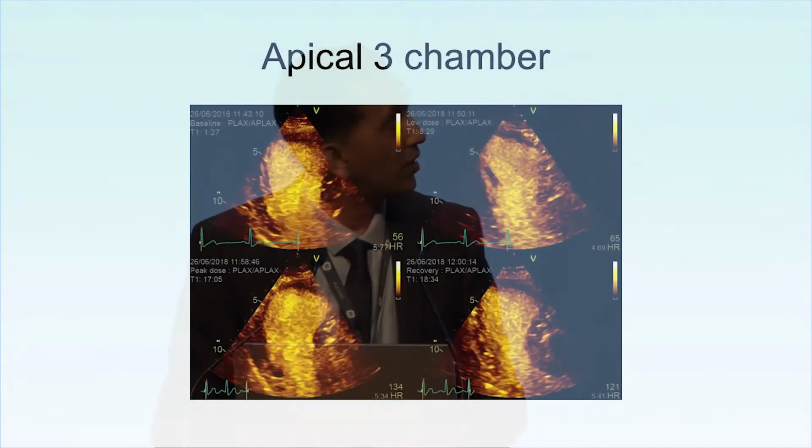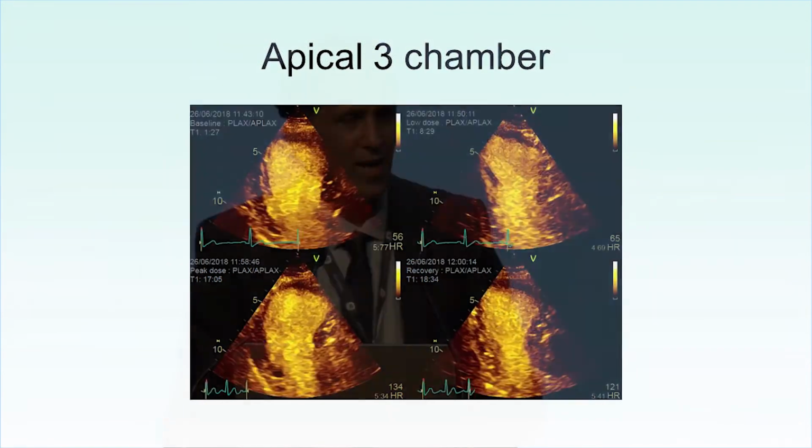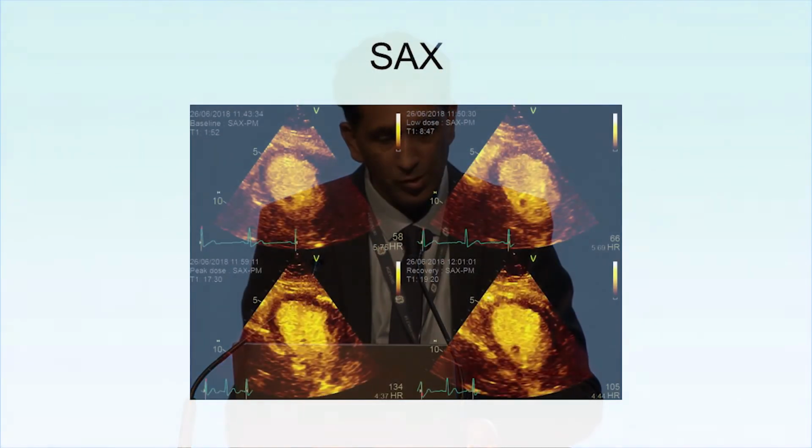So clearly there is something not right there for this patient. So let's go on to the 3-chamber view. And again, that is definitely seen. So we see multiple views. We are seeing changes there. So we're going on to the short axis view there.